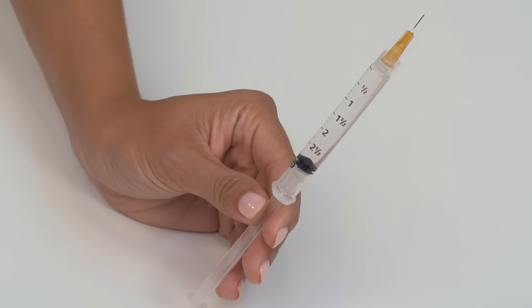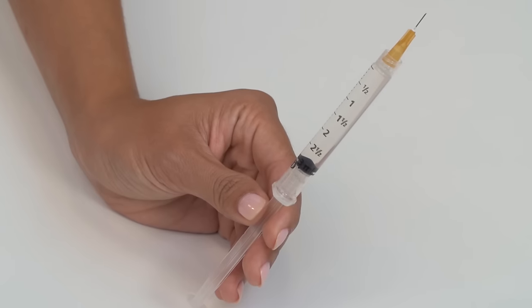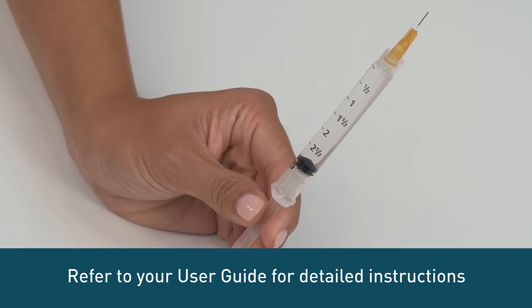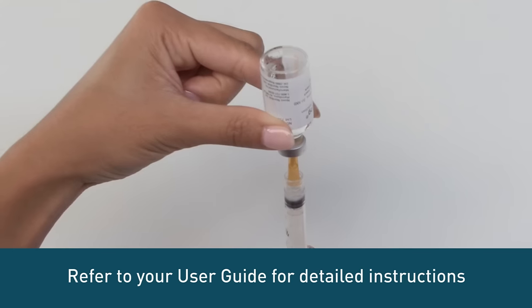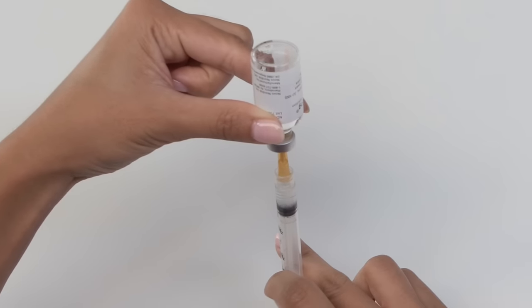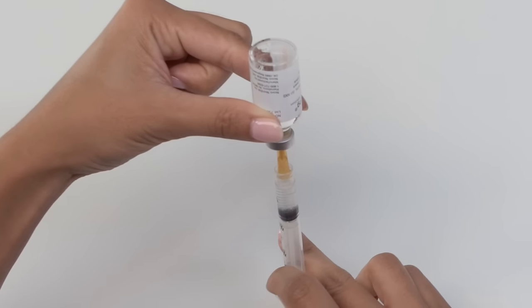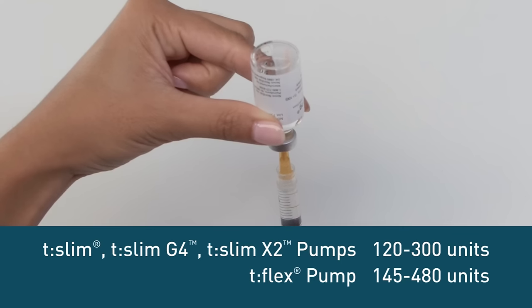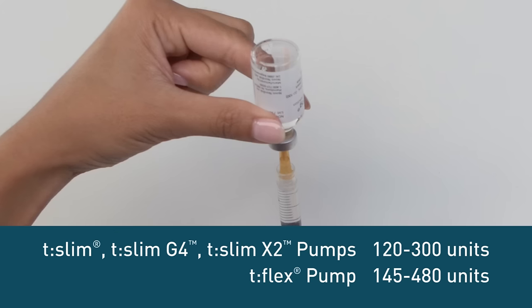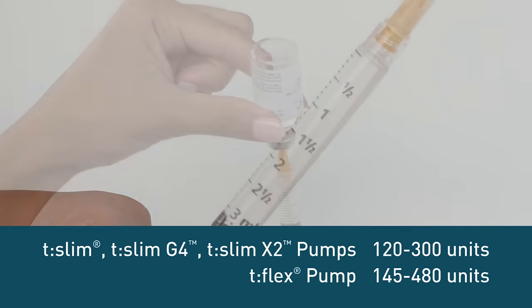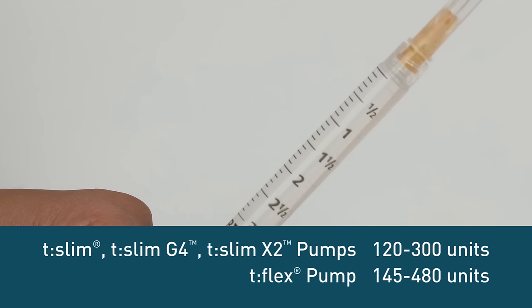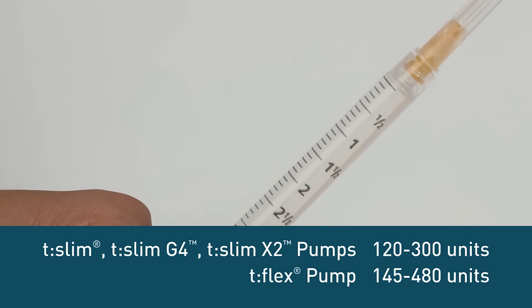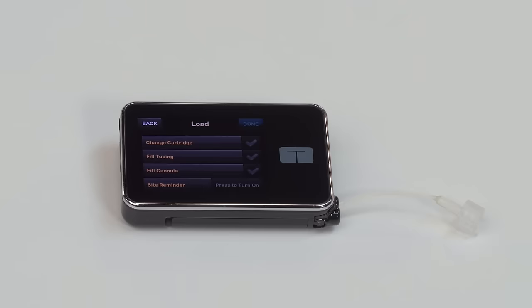We recommend using room temperature insulin to minimize the risk of air bubbles. Refer to your user guide for detailed instructions for drawing insulin from a vial. How much insulin you put in will be determined in conjunction with your healthcare team, but a good rule is to fill at least 120 units, but no more than 300 units for our T-Slim pumps and between 145 and 480 units for the T-Flex pump. Be aware that overfilling can damage your cartridge.